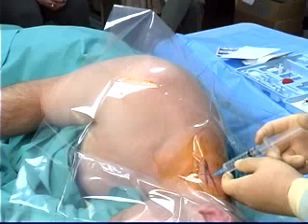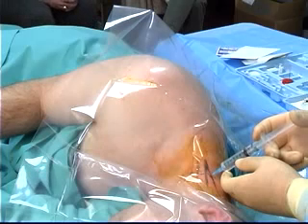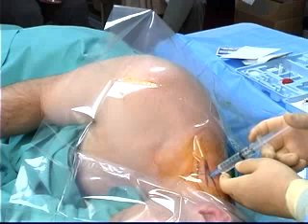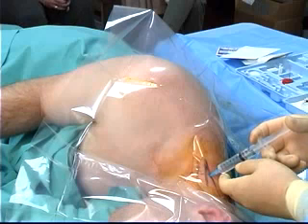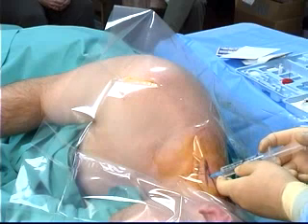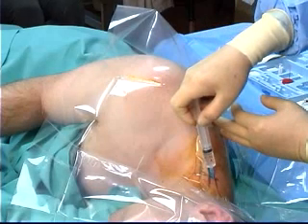No local anesthetic agent is injected until contact with the bony pars intervertebralis articular column or short transverse process of C6 is made. Only after contact with the bone can local anesthetic agent be injected on withdrawal of the needle. This is done to prevent the theoretical possibility of intracord injection if the bony structures are missed and the needle is aimed too medially. The subcutaneous path intended for tunneling of the catheter is also adequately anesthetized.